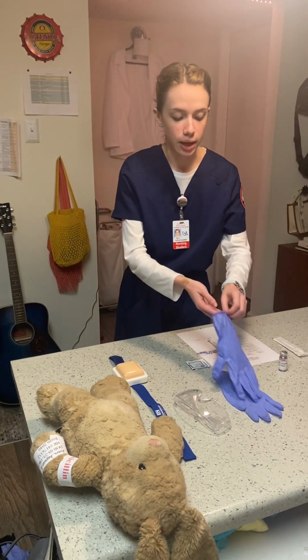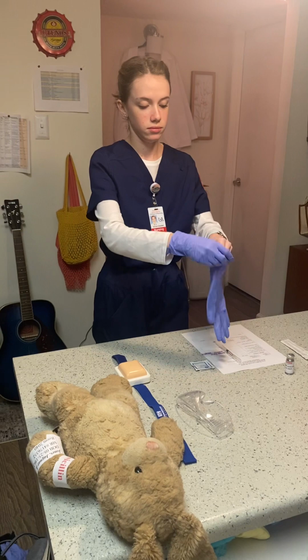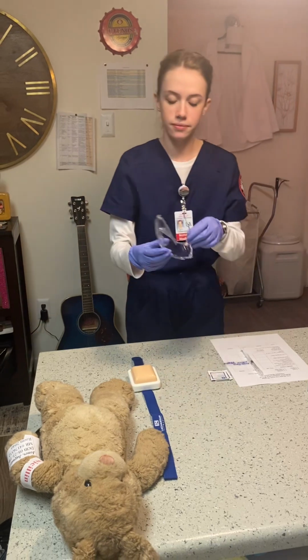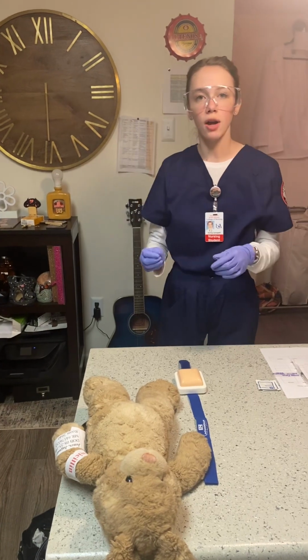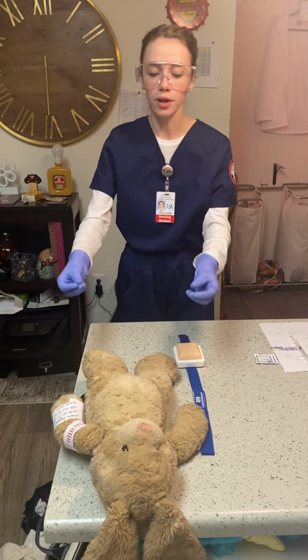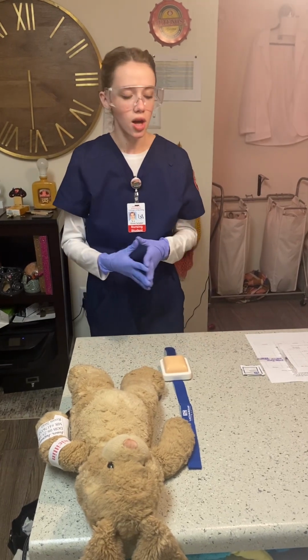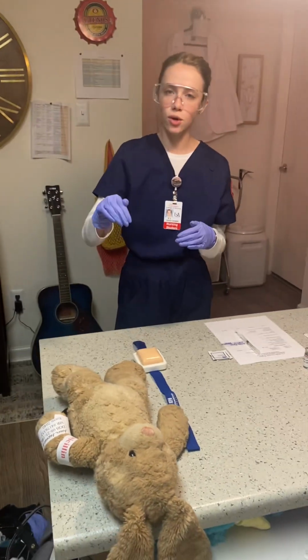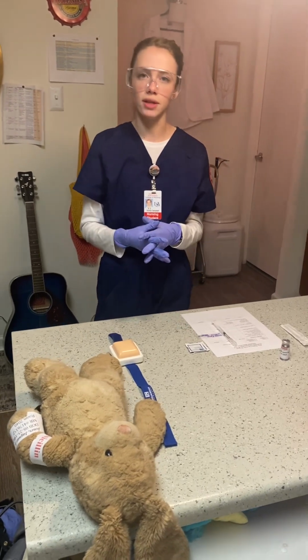I'm going to go ahead and don my clean gloves. I'm going to put on my goggles. And typically this is where I would, since I'm choosing the abdominal site to inject the heparin, bring down the patient's bedding and slightly lift their gown, allowing for as much privacy as possible. So with the abdominal site, you do want to stay 2 inches away from the umbilicus. So I will be administering this medication 2 inches to the right or left of the umbilicus.